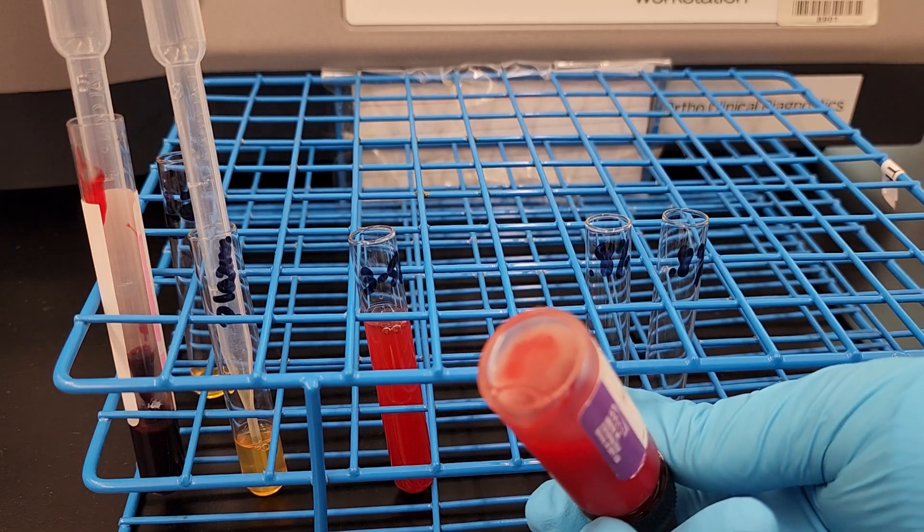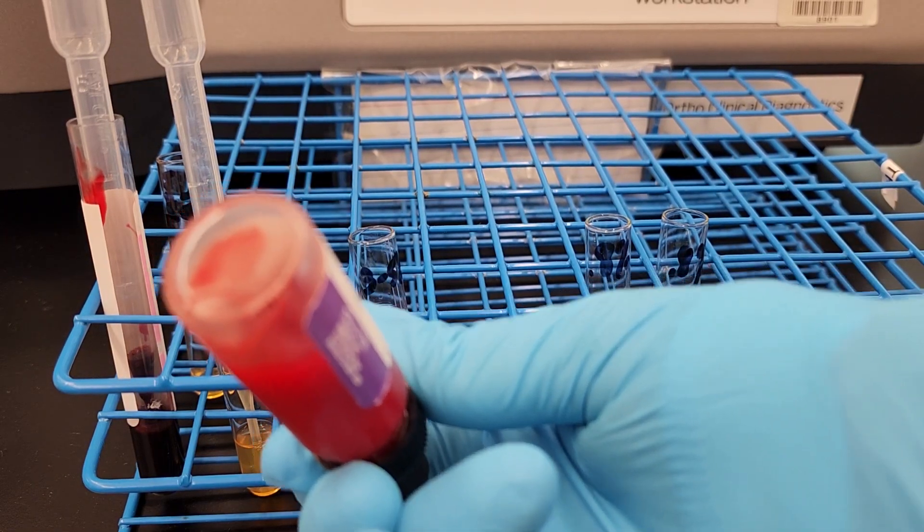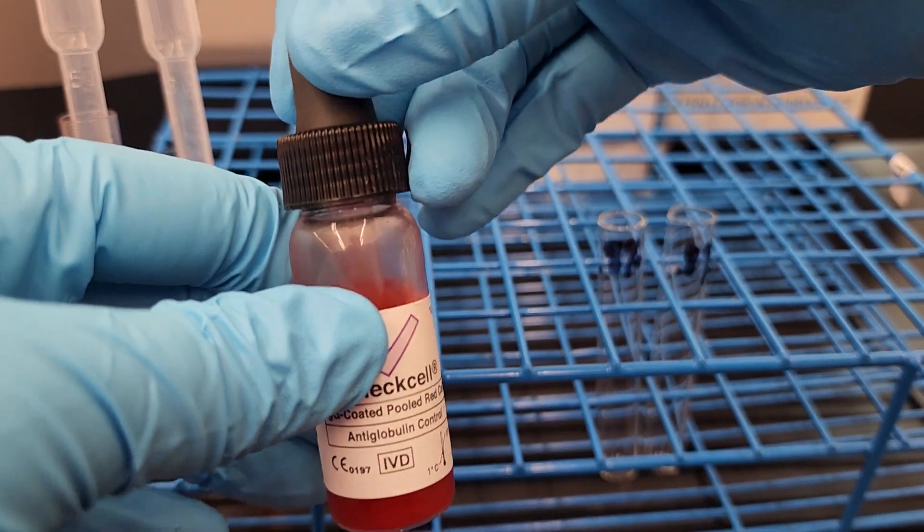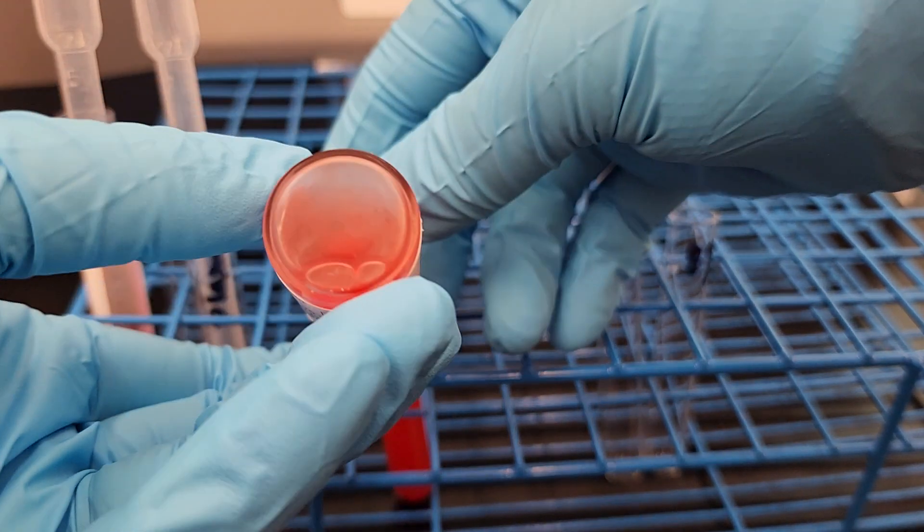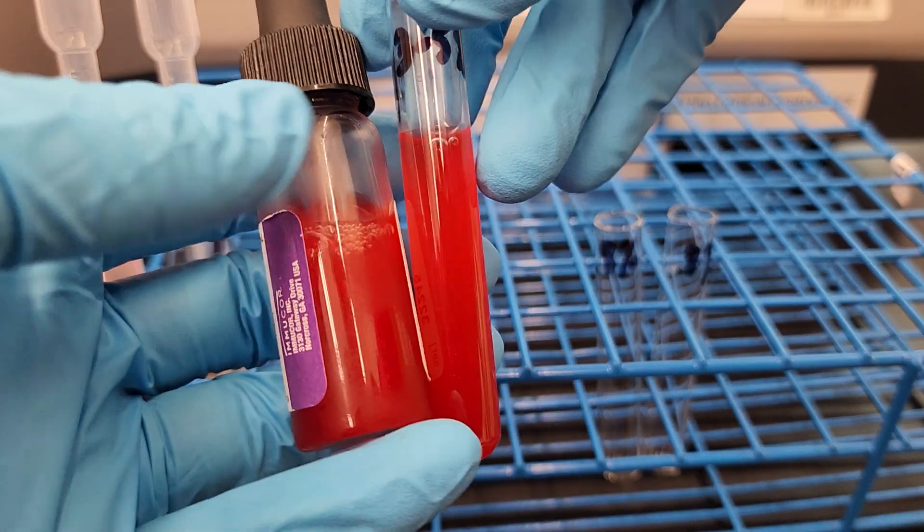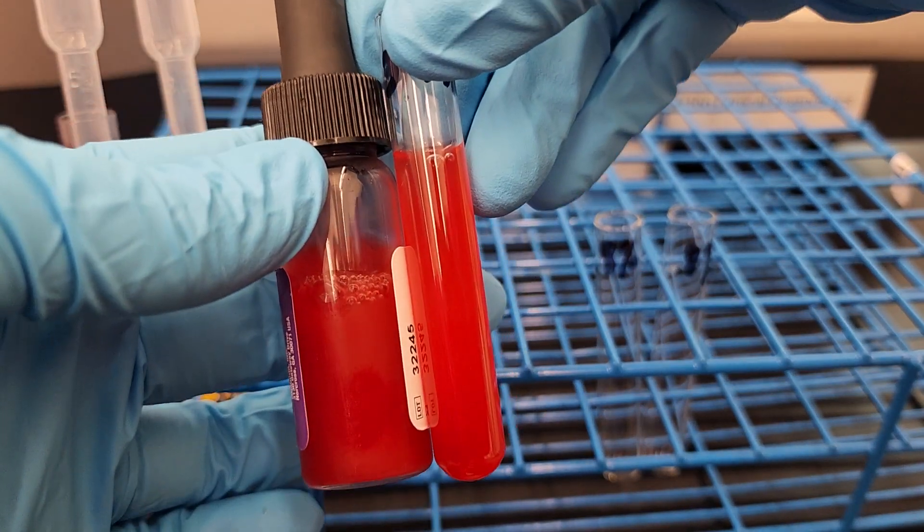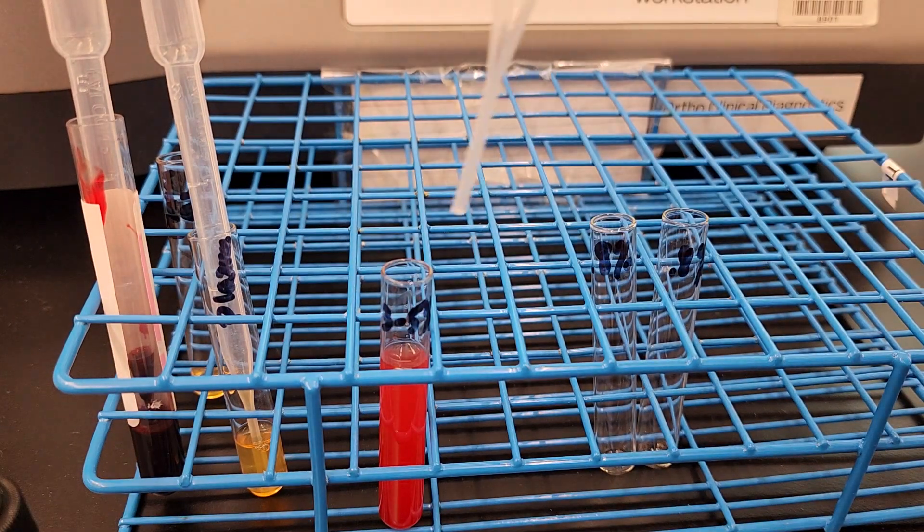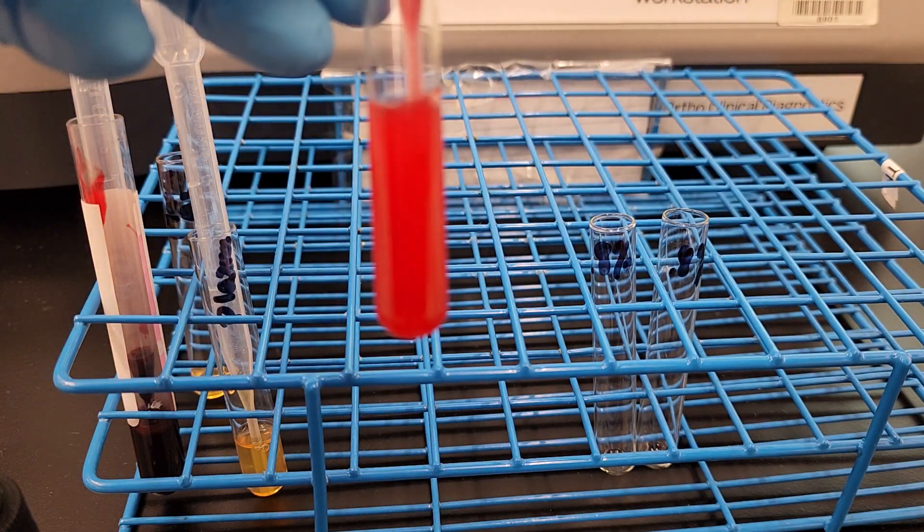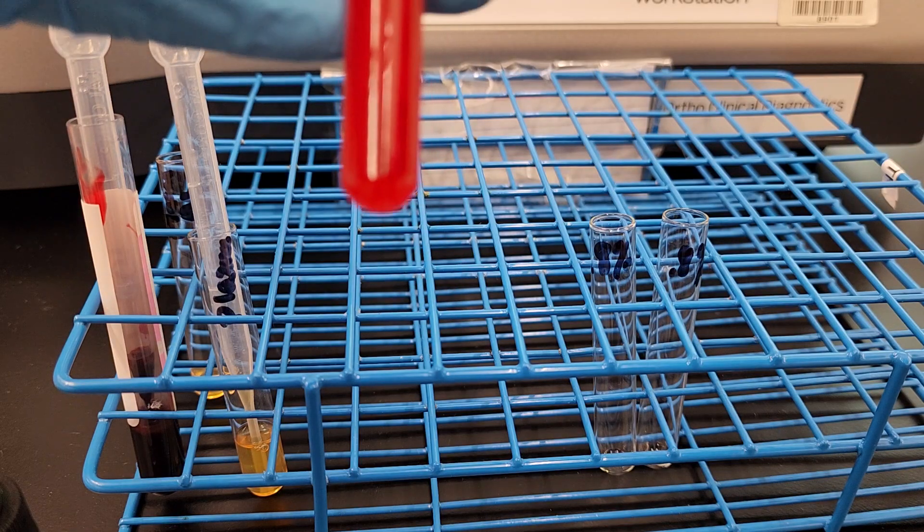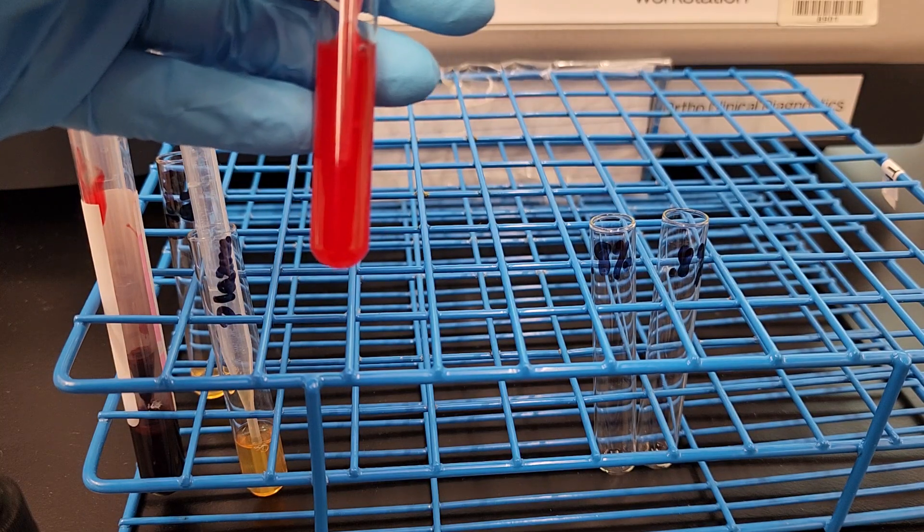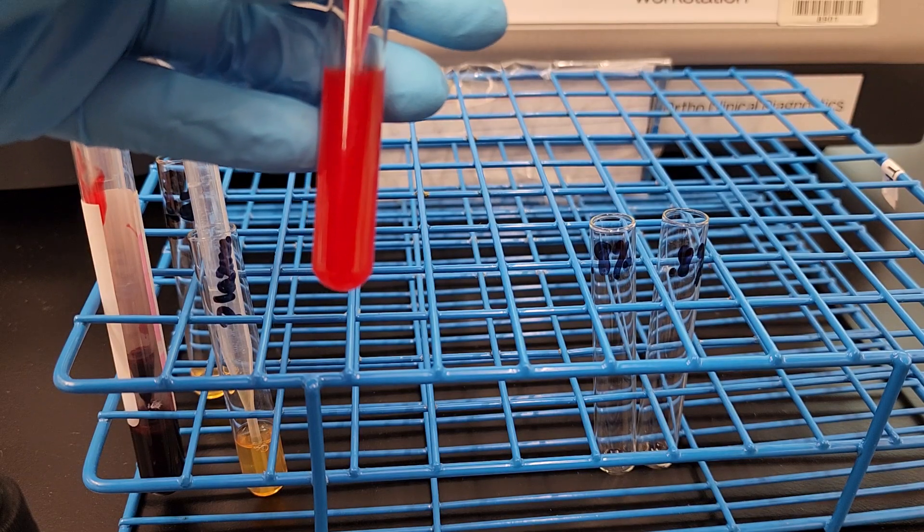So if I can still see red on the bottom, I still have not removed all the cells and resuspended them into the solution. So what you can do is squeeze gently and that's going to resuspend. So now I have something to compare it to. I did not resuspend this already and that's a common problem. It's looking really good, though. But what I want to do is resuspend before I compare. And that way, oh, did you see that? See, the red cells are coming up. They kind of settled at the bottom. Look at that. See, there's some on the side of the tube. So I want to make sure to resuspend all those cells. See, now they disappeared.